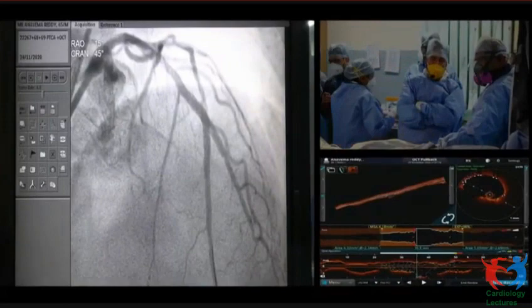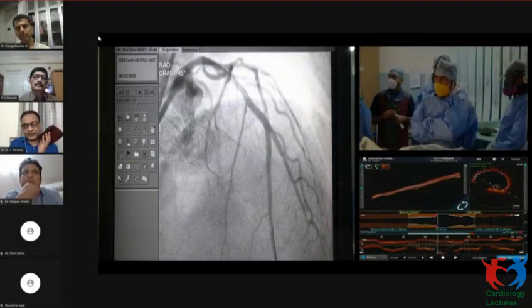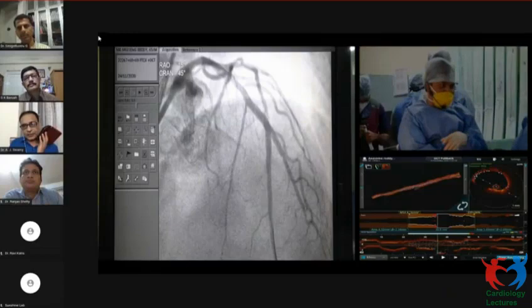the panel was feeling that the proximal part, this appears to be the part where the two balloons, the kissing balloons, have come proximally, and there may be a little bit of elliptical deformation in the proximal segment. And then the POT probably could correct this. Yeah, the POT could probably.